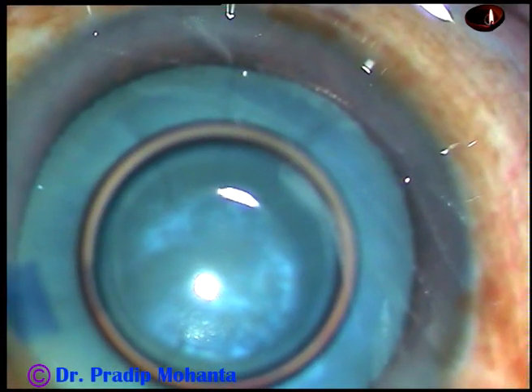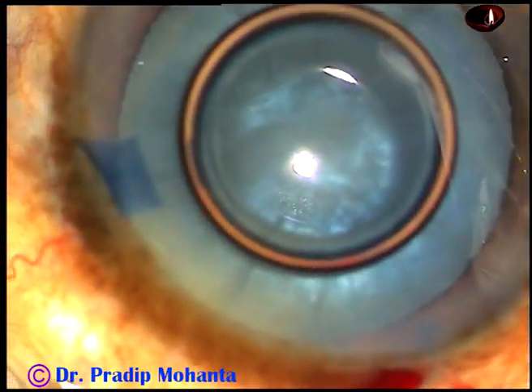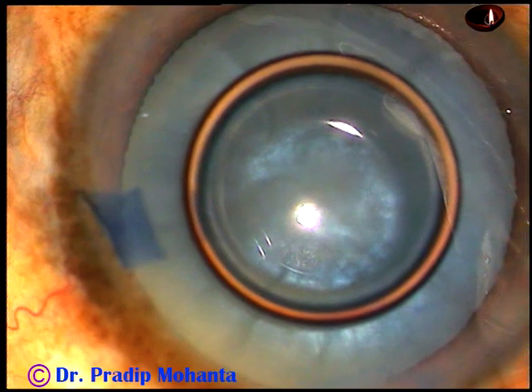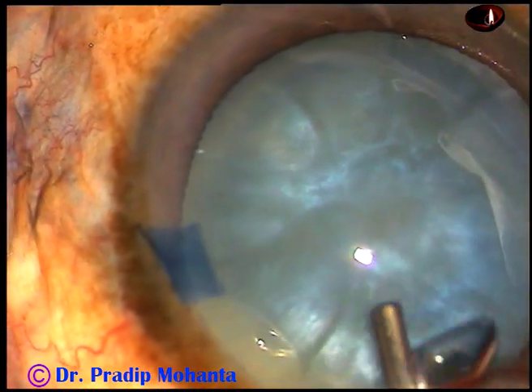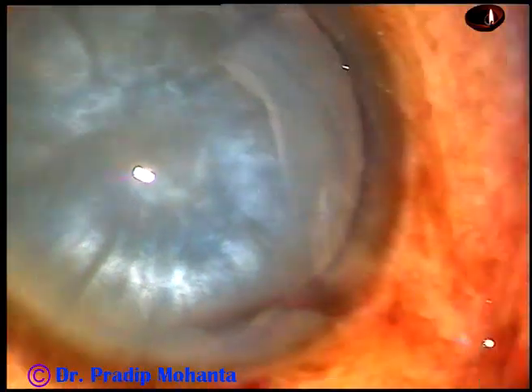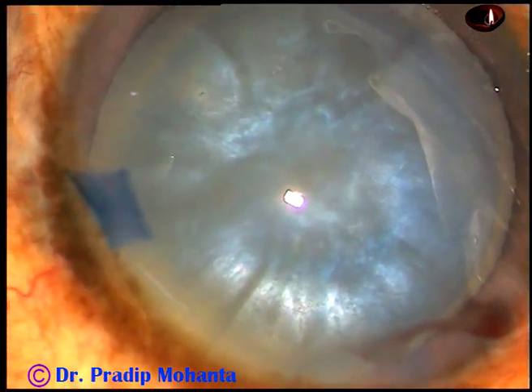Now, 2% hydroxypropyl methylcellulose is injected into the anterior chamber. With 2% HPMC, you can manage intumescent cataracts very well.